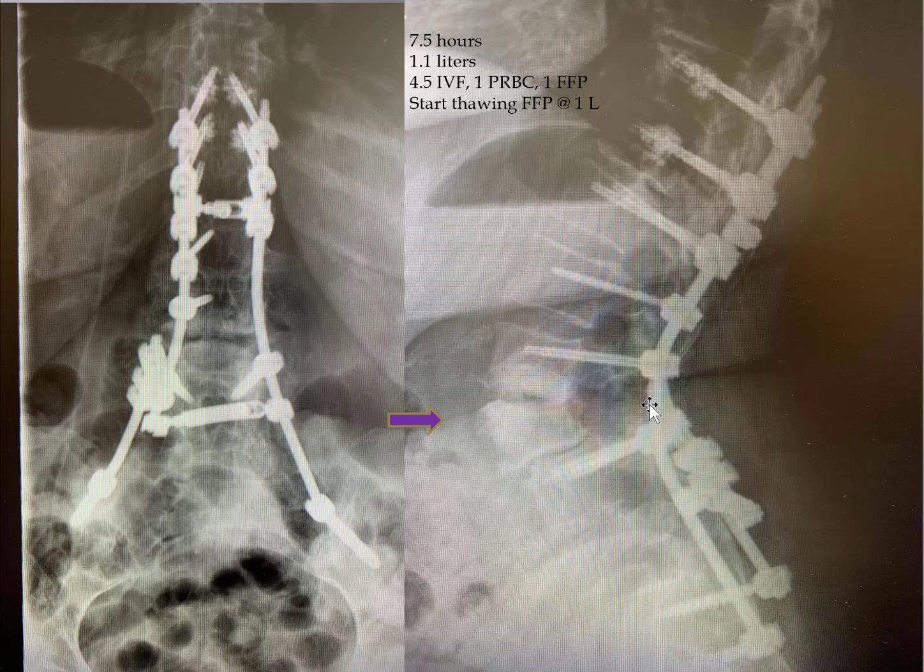And on the left, if you remember, the pedicle is really small. So what I did was laminotomies at both of these levels, and I had a Penfield 4 on the medial wall of the pedicle just so I knew exactly where that pedicle is. And then I put the screw in, and I could do it. I think I could not have done this accurately without a laminotomy. And if you miss the pedicle, you only get one shot. If you miss it, that's it. You can't really put a screw in safely.